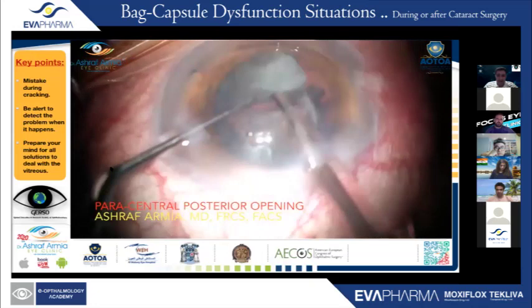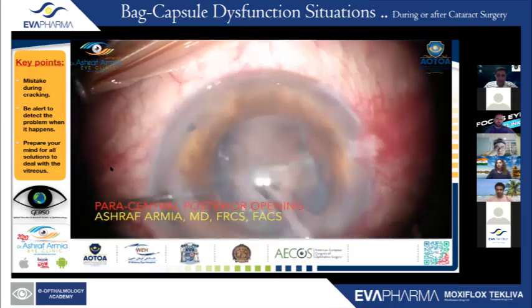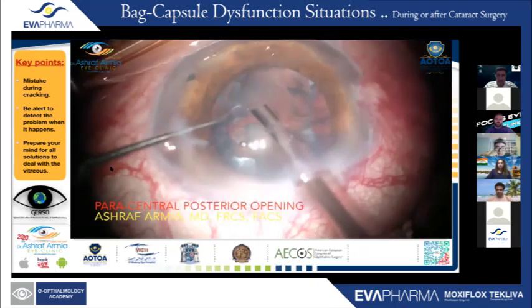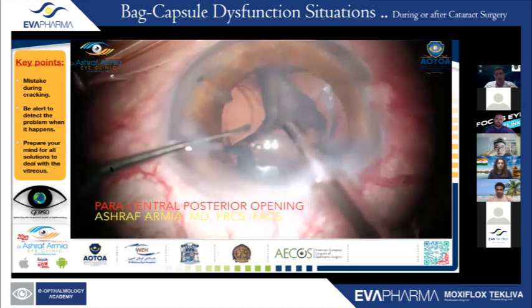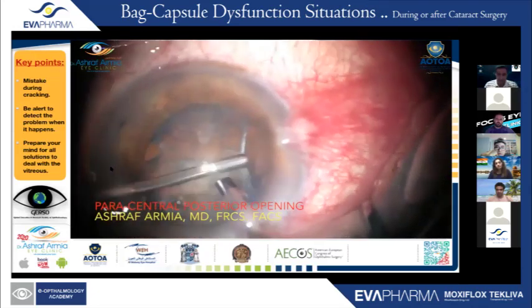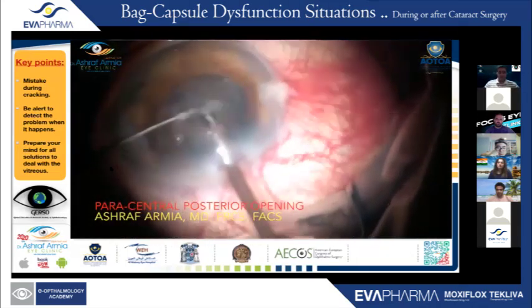And this part, I took this piece, rotation, and at this point, when I take this part, you're going to see it now. I make a slow motion. See, there is an opening in the posterior capsule. So I took the decision, either I do anterior vitrectomy or pars plana vitrectomy. My decision in this case, I did anterior vitrectomy. I didn't do the posterior vitrectomy.